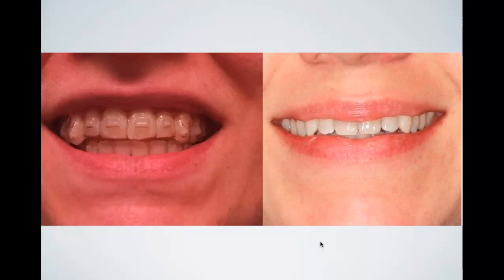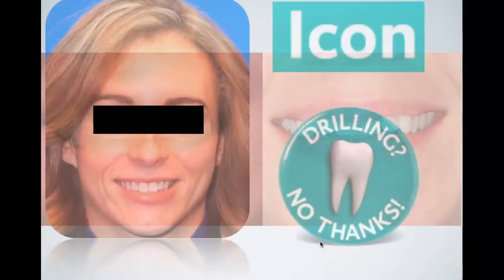Yeah, so between the two, my thoughts are the Lux Creo one's probably going to be the one that comes out on top in the end, at least with the current formulations, because it allows you to produce a little bit more force. One of the challenges with these 3D printed materials historically is that they can't create enough force to actually get the teeth to move, and so basically with the Lux Creo material, without being so thick, right? You don't want a material that's 3 millimeters thick. No one's going to be able to wear that. But now the materials have gotten to the point where they're a little bit stronger. So the Lux Creo material, in my experience, is a little bit firmer, so you can probably get a little bit more movement with that. But we're still in its infancy there.